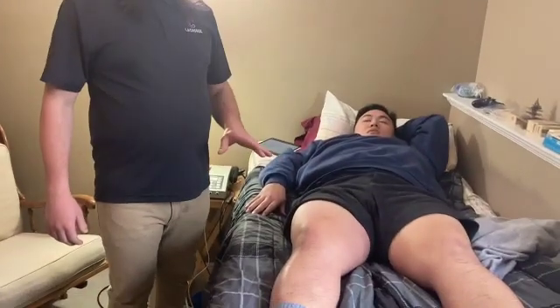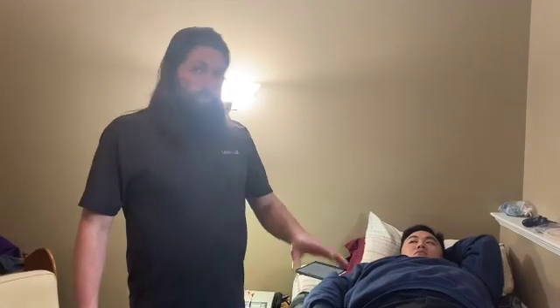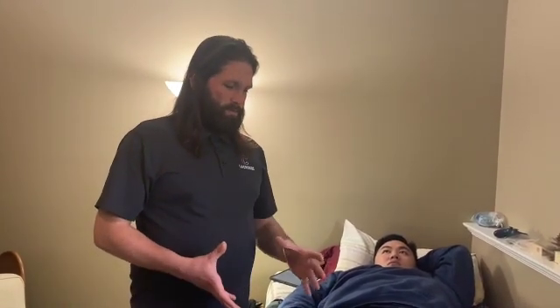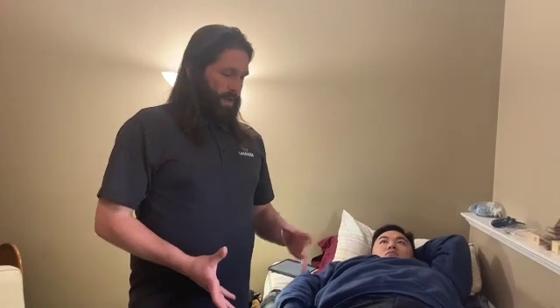We're going to try to stimulate the alpha beta nerve fibers to utilize the gating theory to kind of block out the A delta and the C fibers, which are the nociceptive fibers going to the dorsal horn, and kind of block those pain signals being transmitted up to the brain by utilizing some high frequency TENS from the electrical stimulation machine.